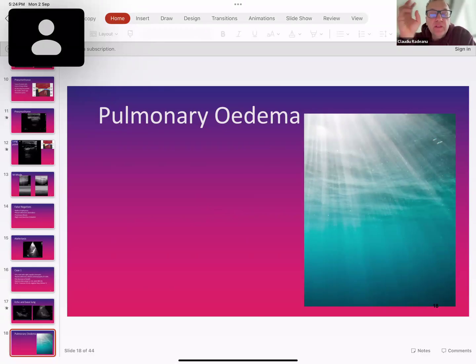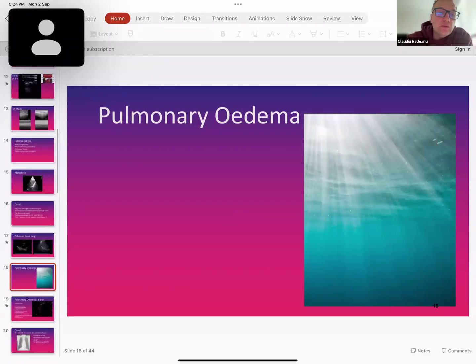But when you have filled with water, the ultrasound waves go through the lung now, so that what we call it, the lung becomes echogenic. Okay, so that is what we were referring to, increasing echogenicity of the lung. And let's go through the next.